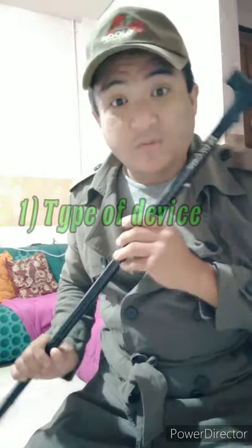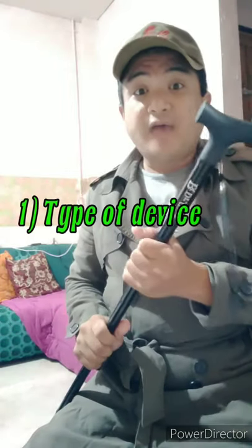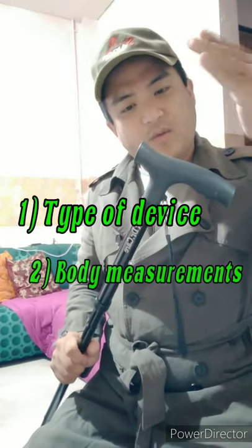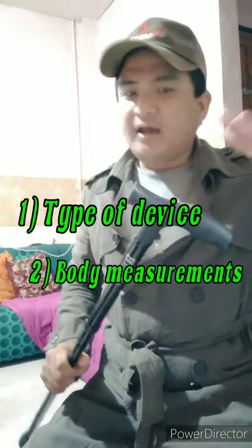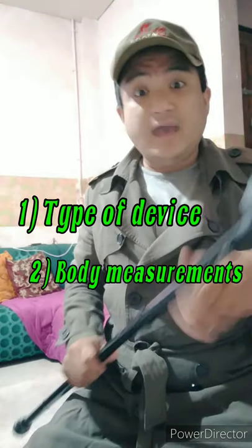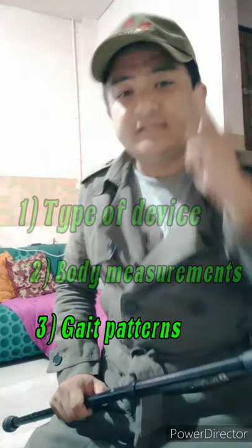number one, we have to identify what type of device we are going to use. Second, we also have to know the different measurements of our assistive devices — the height of the device. We also have to understand the different gait patterns, and of course safety is always our priority. So let's start with the parts.